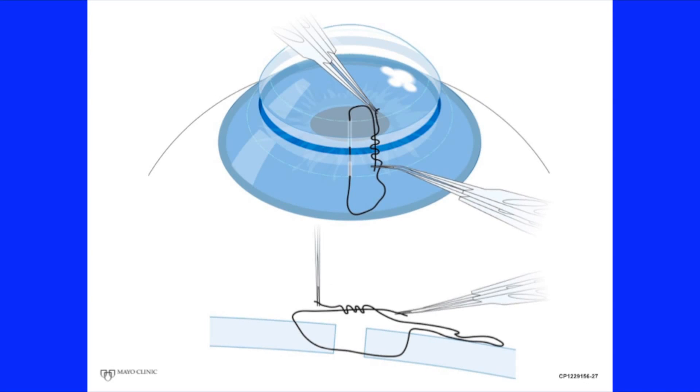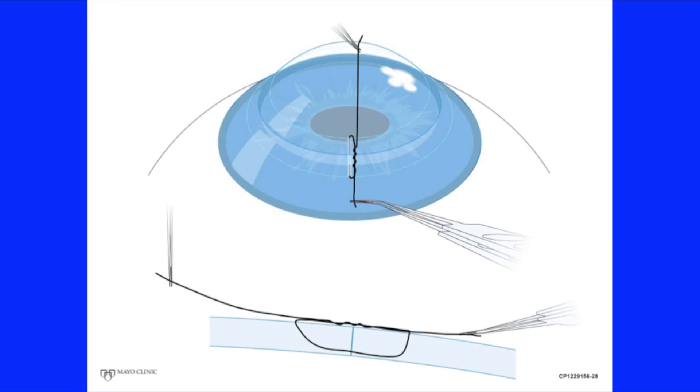Then move the short suture towards the host side of the wound. Do it on a line parallel to the suture that is through the graft host interface. Pull gently so there is still slack in the system. Now make a series of stop and go tugs that pull the same amount on the short and long suture.